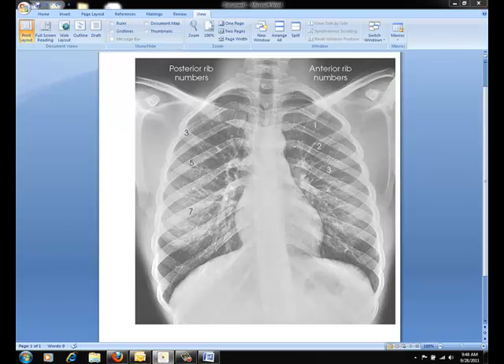For the AP projection above the diaphragm, you should see the 1st through 10th posterior ribs from both sides. For the ribs below the diaphragm, the 8th through 12th ribs should be best demonstrated. Be sure that there are ribs visible through both the lungs and the abdomen.